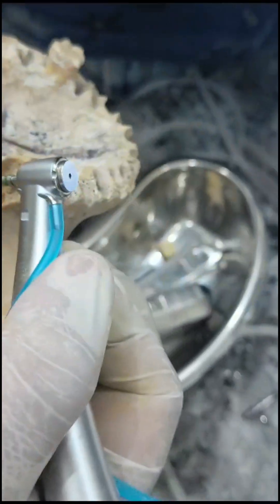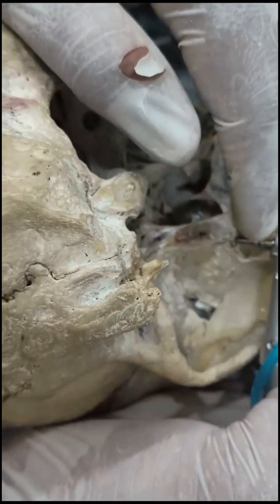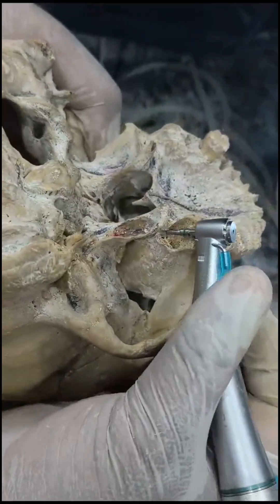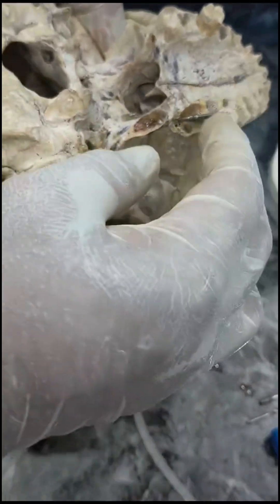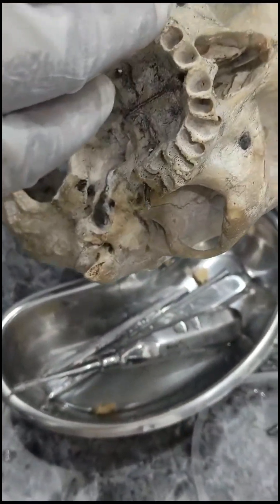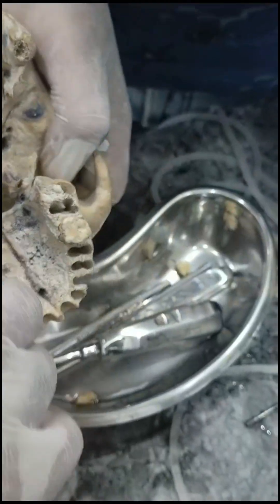At this point where I got my desired depth, I'll take out my drill and measure it with a scale. We can also take an X-ray to see how things have gone and the area of penetration. This is our marking spot.